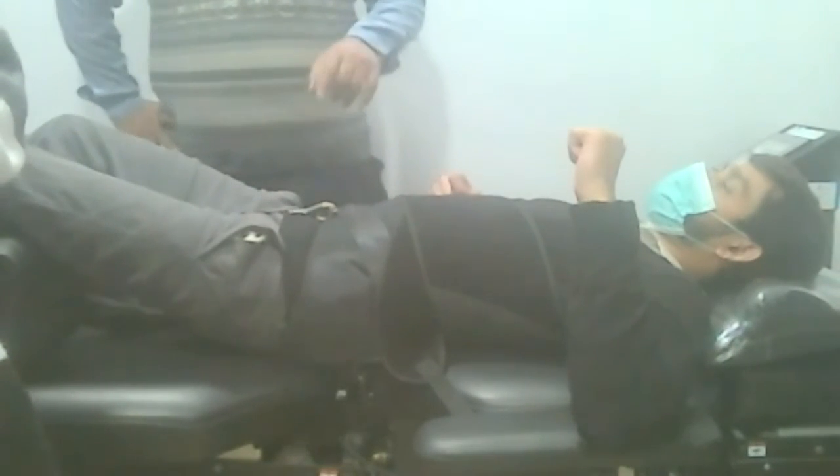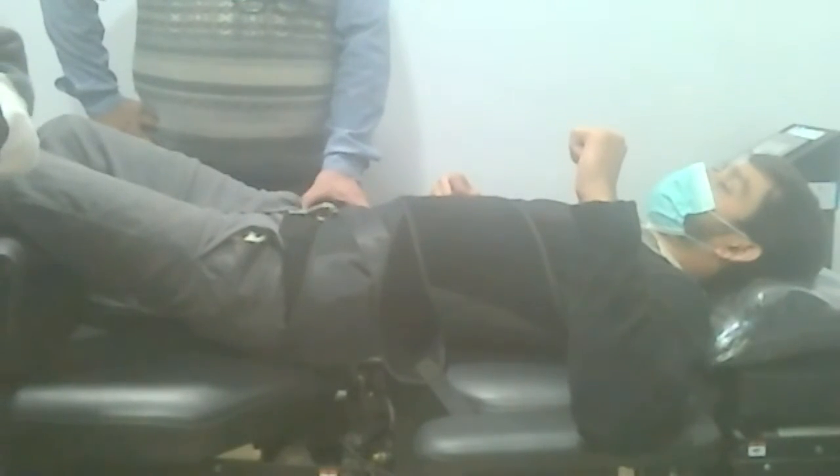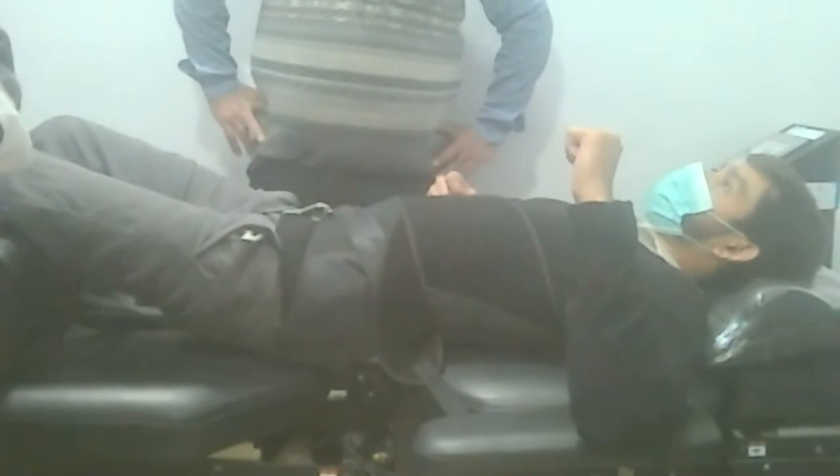Treatment is for L5-S1. So the table distance has increased. This cushion is moving. So what's happening is his upper body is staying still, with the thoracic harness holding his upper body still, and then all the force is going through the lumbar portion of the table.